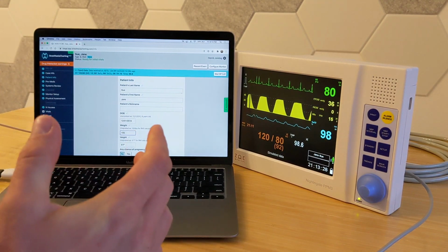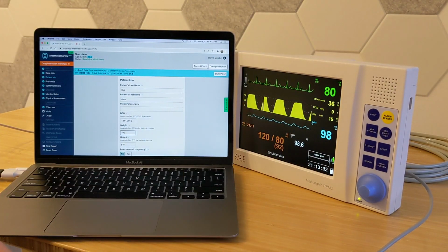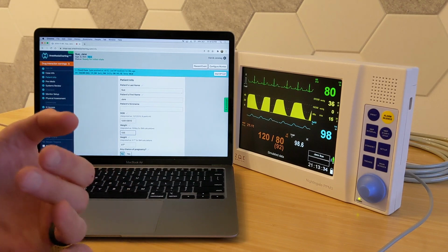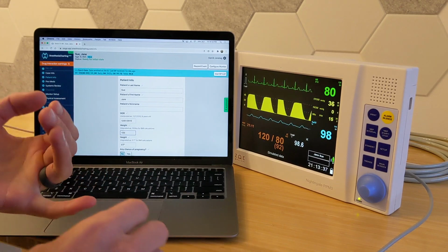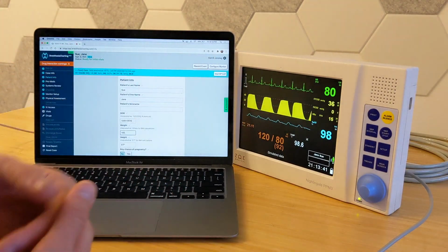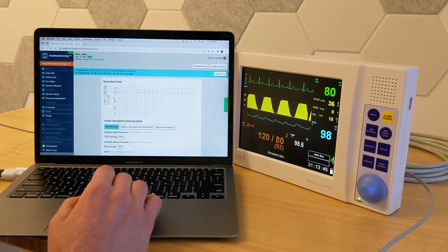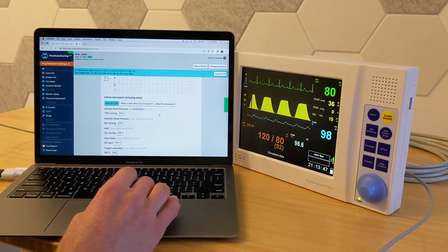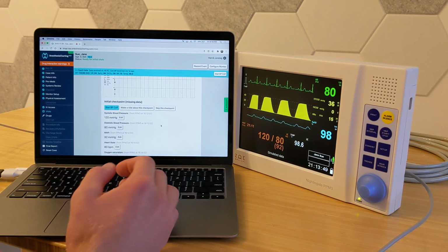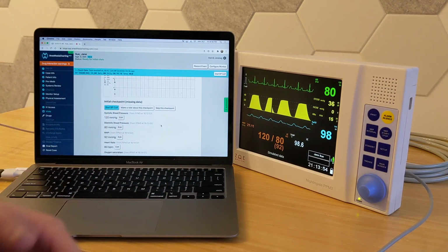So, at this point, we basically just start our case, and then anytime it needs, whenever we've given our first drug to initiate the case, then anytime it needs another vitals reading, it's going to take it off the monitor and put it into the chart for us. And again, you'll always be able to see here where it came from, at what time, and what the values were, and make any adjustments that you want. You can always override stuff. If someone's leaning on the blood pressure cuff, or it's just wrong and you want to fix it in the chart, you can do that.